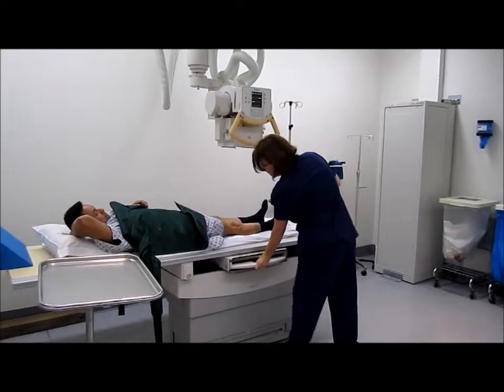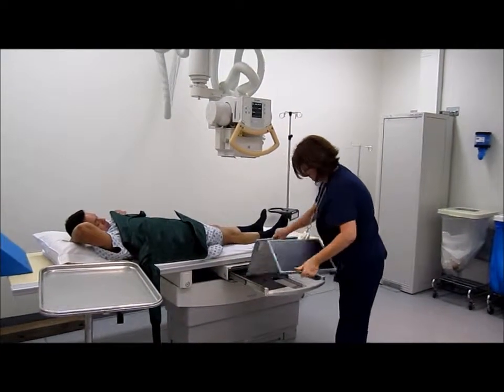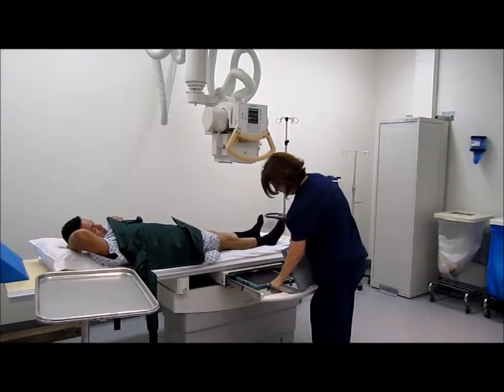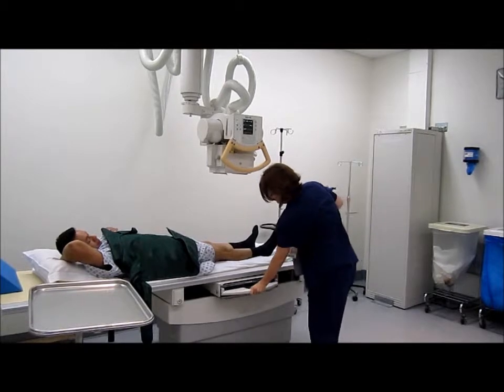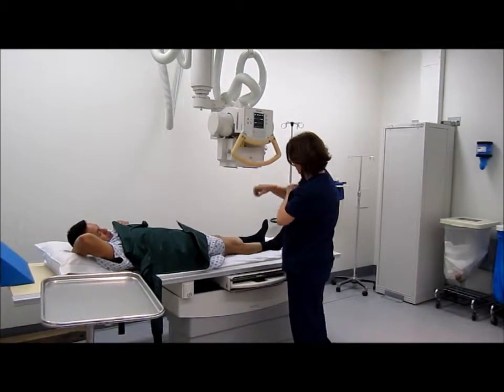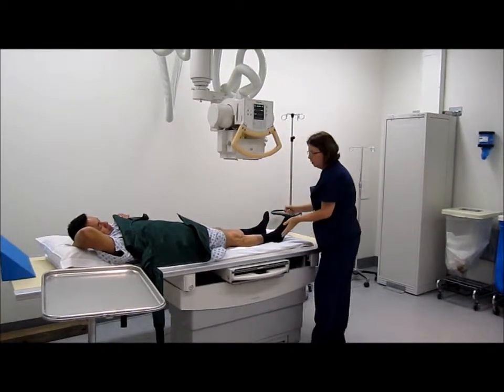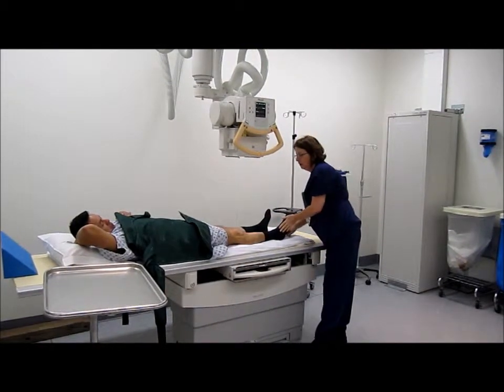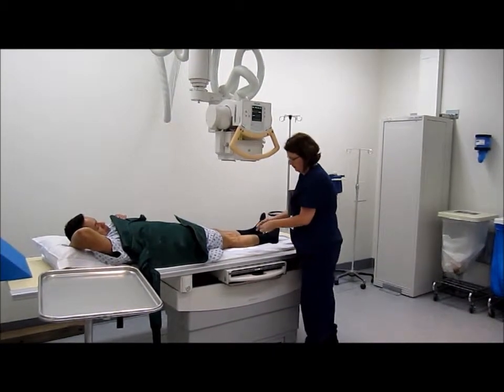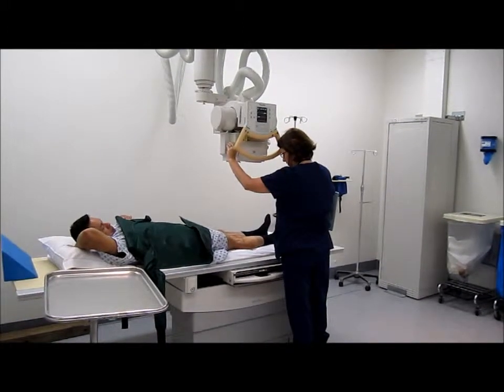So now for the internal oblique, change out my cassette. I'll be centering at the same position, half inch below the patella. And I'm going to have the patient rotate his leg in 45 degrees, maintaining the same elevation.